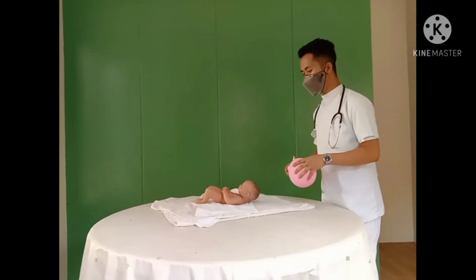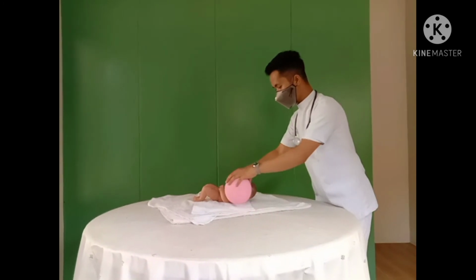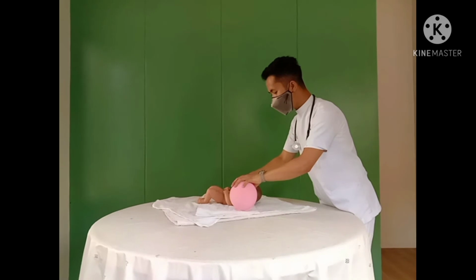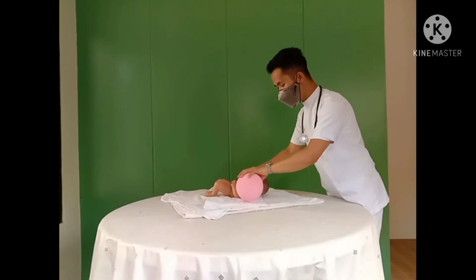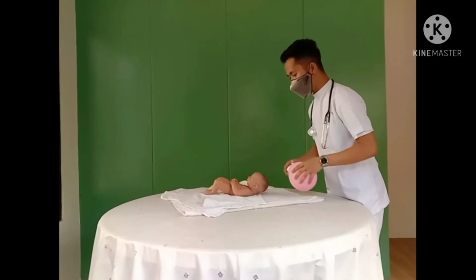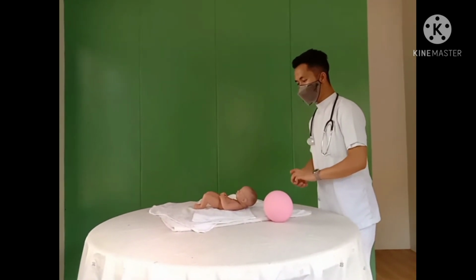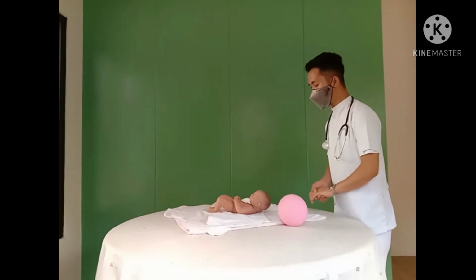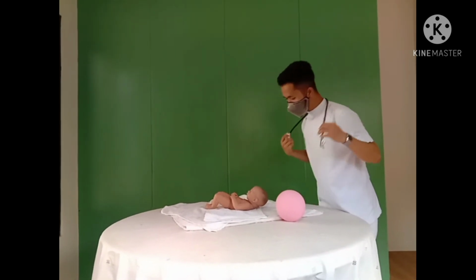We will start the equipment 5 times for the breathing of the newborn. 1, 2, 3, off. 1, 2, 3, off. 1, 2, 3, off. 1, 2, 3, off. 1, 2, 3, off. And then after 5 inflation breaths, reassess the baby for changes in assessment.